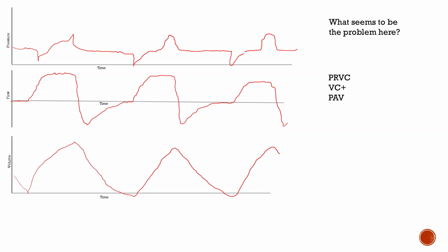circuit has. And it's not guessing by looking at the patient and seeing how much the patient is participating in the breath. It's guessing by sensing the numbers that it's getting from reading what the pressure is, what the compliance is. So if you have a patient that's awake and taking a nice big breath like this, with a negative pressure inflection here, the ventilator is going to sense that it's a very highly compliant circuit. The patient does not need much support to get tidal volumes, because it's sensing a low pressure right there. So it's not going to give the patient pressure.